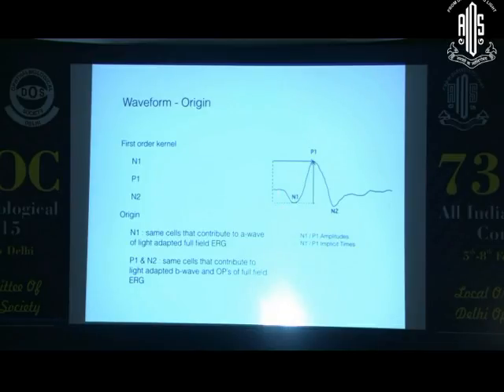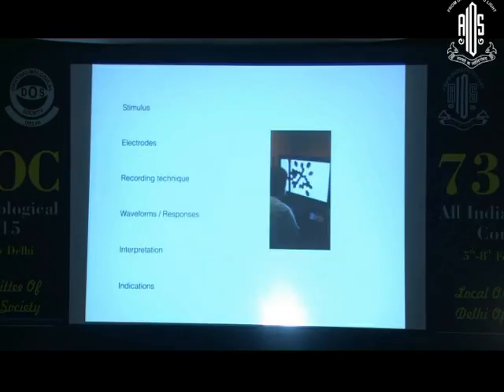And if you compare this with the ERG waveforms, the N1 is contributed more or less similar to what you get in the A wave in an ERG, and the P1 is contributed from similar cells, like the bipolar cells, as in an ERG pattern. But this is not really an ERG pattern, because this is a more mathematically derived waveform that you get here in a multifocal ERG.